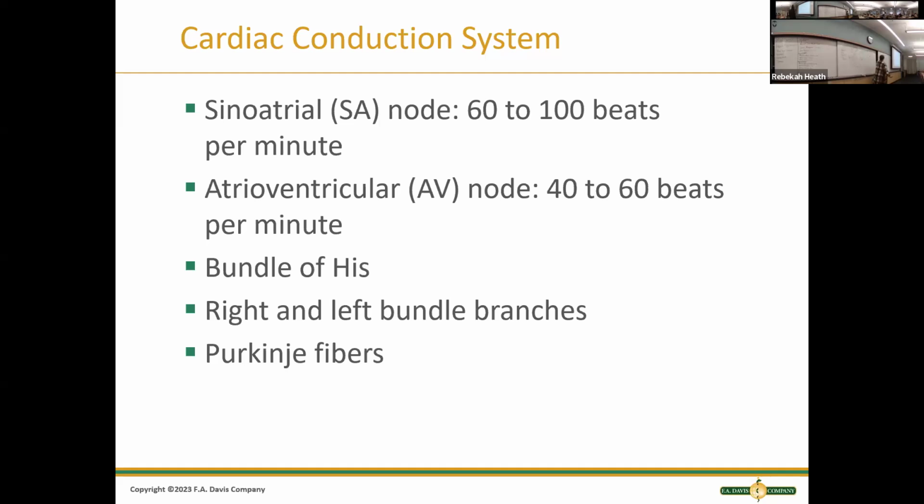Now, when you start looking at interpretation, it's with this special paper that we use, and that's how we know how long it takes, because that electrical signal actually shows up. We found a way of tracing it on paper, so if something is longer or not what it should be, it's letting us know that the signal isn't getting sent through like it should. That's all I'm going to talk about blocks for right now.